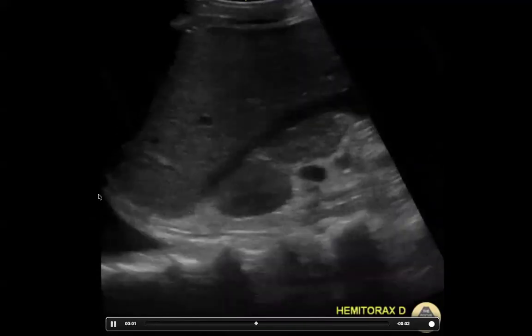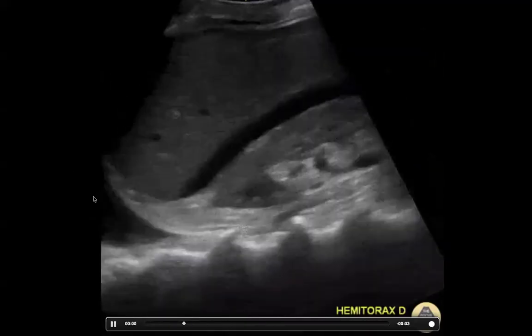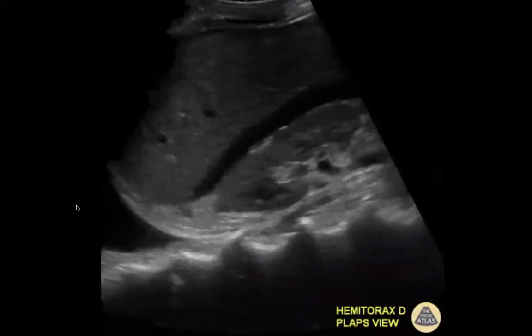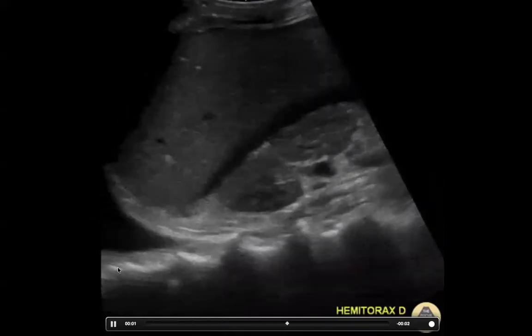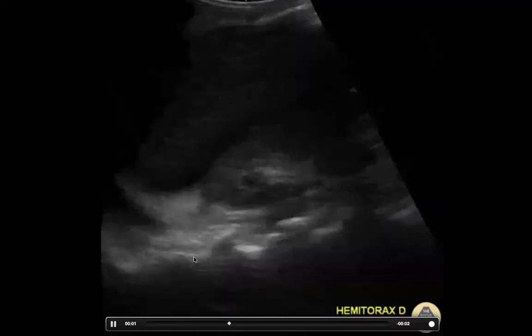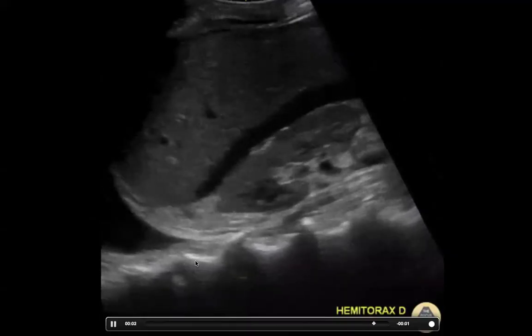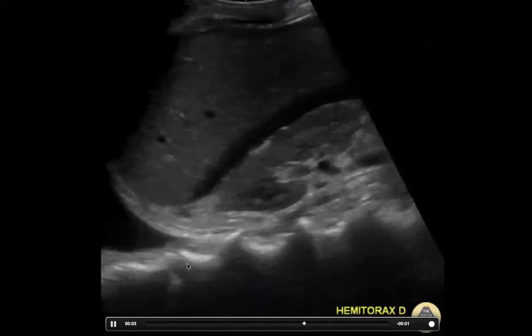But because of the presence of pleural effusion here, whether it's filled with fluid or blood, ultrasound waves can shoot through the fluid and then show the spines that are deep to this fluid here. This is what's called spine sign. When there is extension of the bright white spines in the back, superior to the diaphragm, that's a positive spine sign, and that means that you have the presence of free fluid.